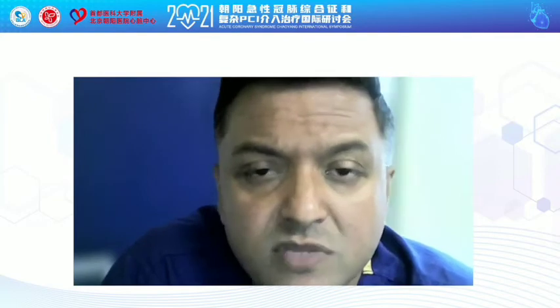I think that's a very good question. Sometimes it's quite hard to predict what techniques you're going to use before you start, because especially with a CTO, there are certain characteristics from the JCTO scoring system that you can use to at least understand what your outcome might be and how far up you're going to progress through an algorithm. But often it's only when you're in the case and you've got your wires and your microcatheters where you want them to be that you start to understand the true nature of the occlusion and what your challenges are going to be. Personally, I would generally always start with a balloon approach in the first instance. But I would also try and maximize other things prior to that.